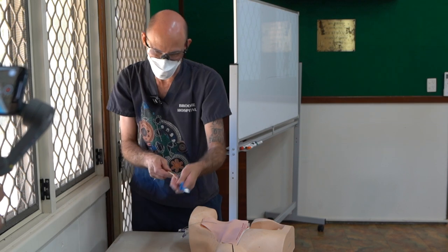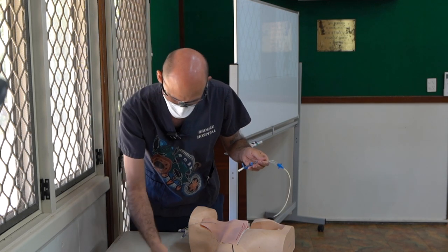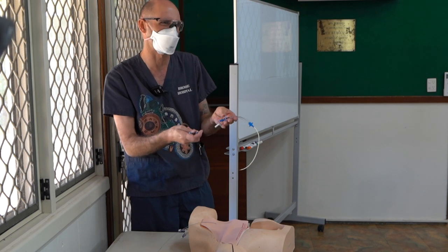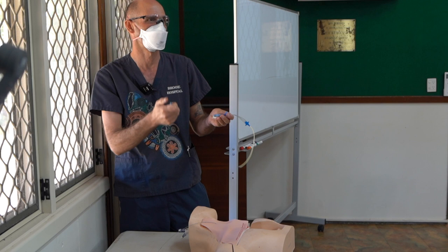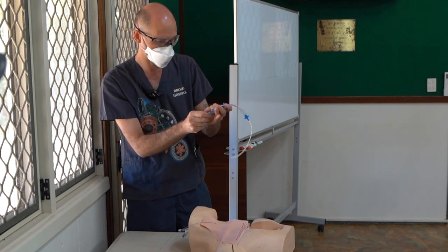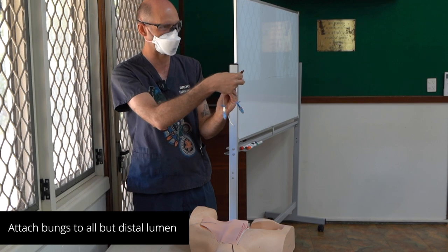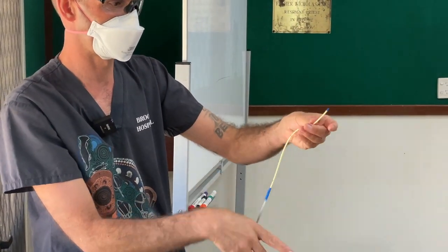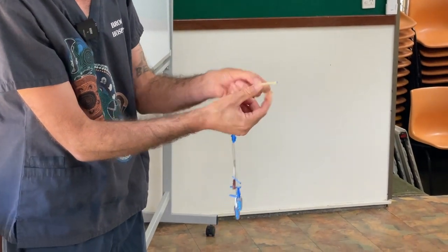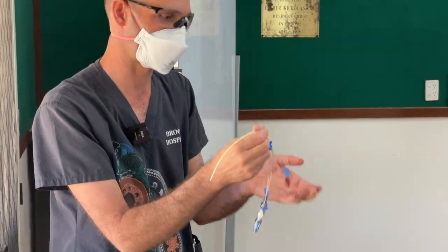This catheter has already been flushed with saline. These bungs — why do I use them? You don't want blood still coming back and clotting off, so they stop the backflow. I clamp off the ports but leave the brown one — the distal port — open. There are three injecting ports with holes: the distal hole is where the wire's going to come through, and the other ports are for medications. When I feed this catheter over the wire, the wire's going to come out the brown distal hole, so I have to leave that open. That's all ready to go.